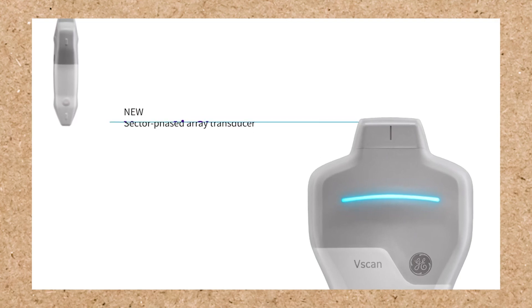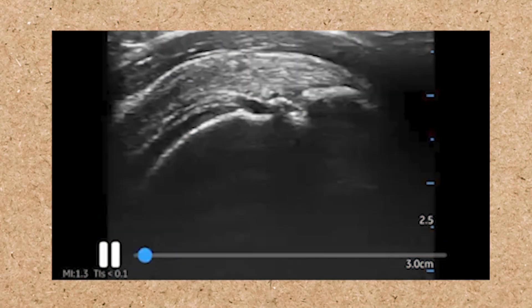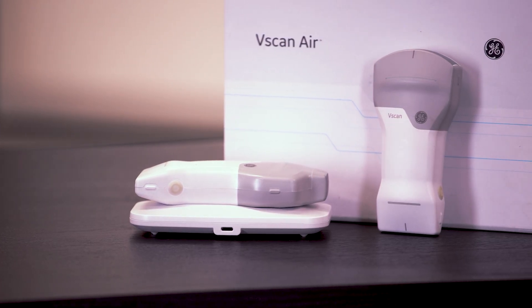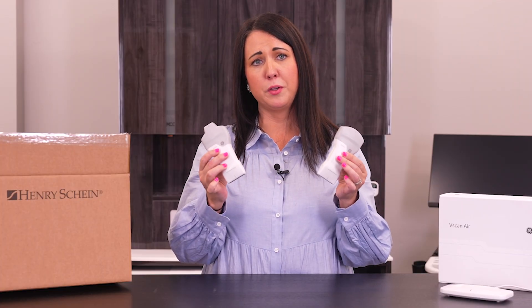We're gonna put the CL away and put that on the charger. The SL is the latest and greatest from GE for cardiac imaging scanning. These are military drop-tested devices — you can drop this from four feet and you're not gonna damage this probe. It's got a three-year warranty on it. If you have a problem with your probe, call your Henry Schein representative and they will help facilitate getting this to GE and get you a new probe.